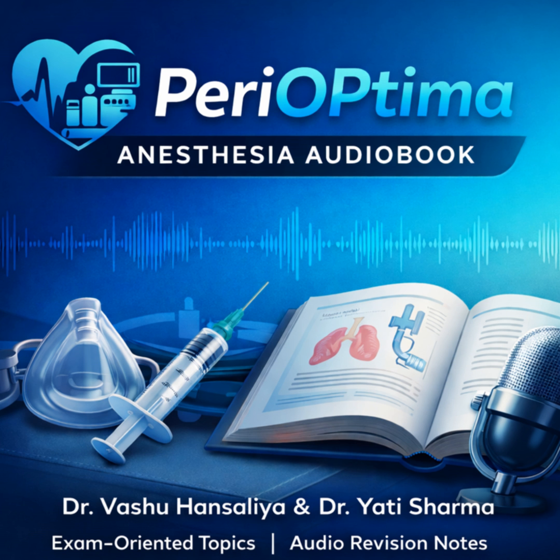And on the ILMA or Fastrach, you have to highlight the rigid handle and the specialized epiglottic elevating bar inside the mask. Examiners look for these technical features. Finally, we've covered a lot of ground. How does a candidate synthesize all of this into a structured, high-scoring, 20-mark answer?